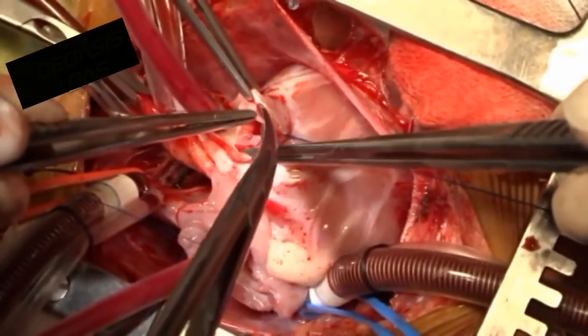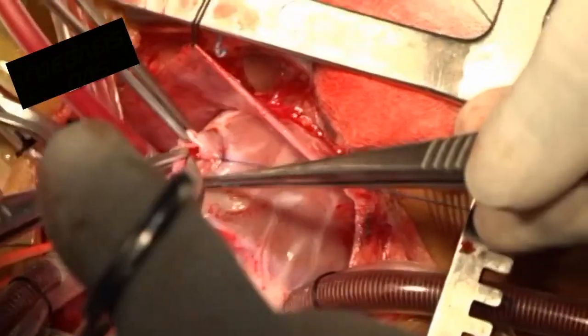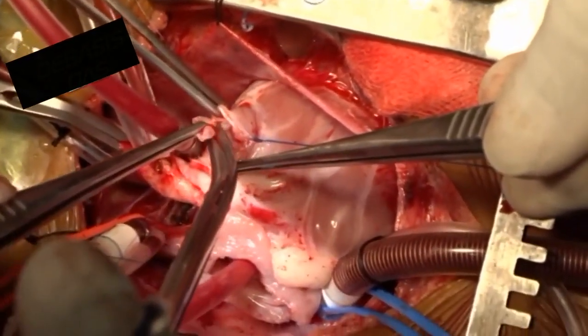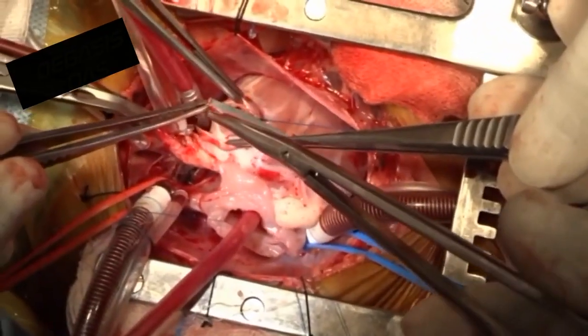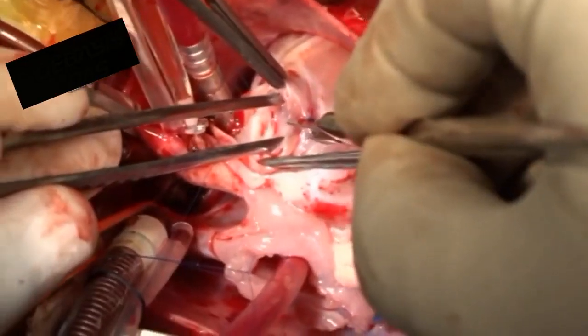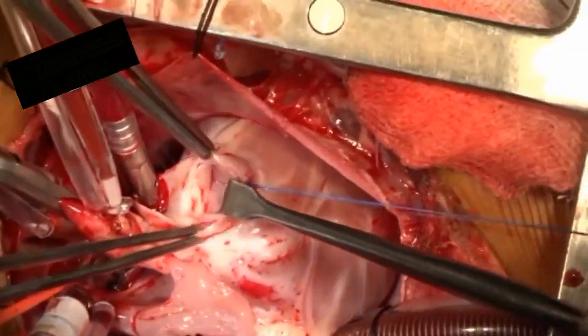In this case, the pulmonary artery is further opened. The pulmonary valve was very dysplastic and is being excised. It is a choice to use a monocusp or a bicuspid valve in the RVOT in future reconstruction. In this particular case, a transannular patch was done without any valve.